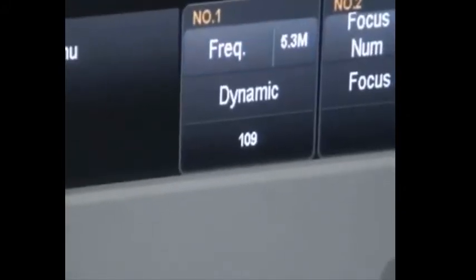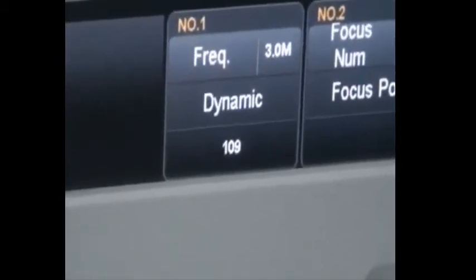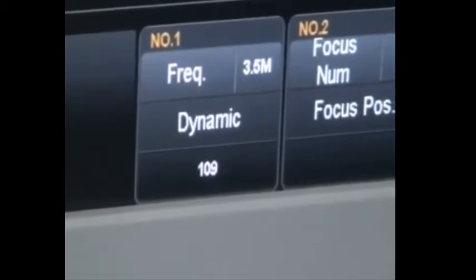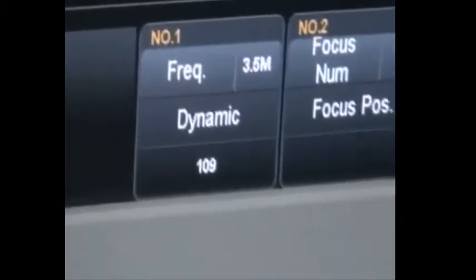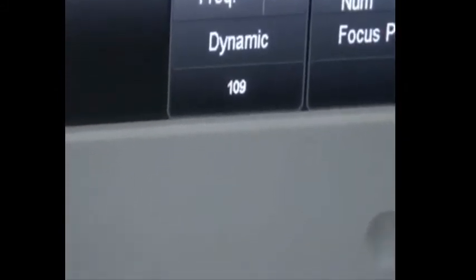Frequency. Press this knob to adjust. If the patient is fat, we should choose a lower frequency to get a better penetration. If the patient is thin, we should choose a higher frequency to get a better resolution. The higher the frequency, the better resolution, but the lower penetration.